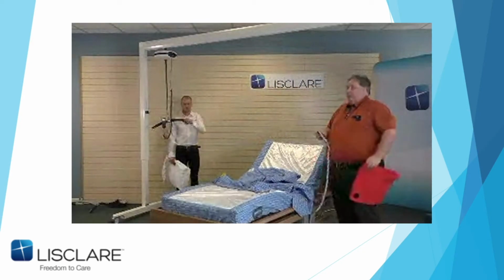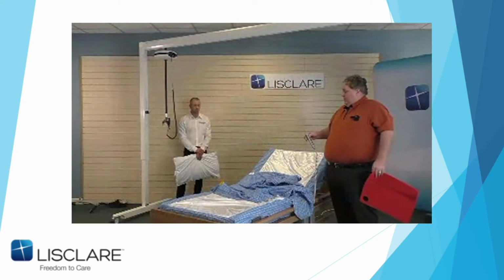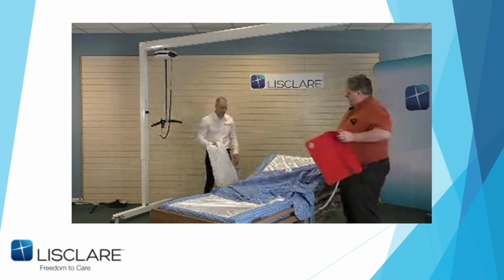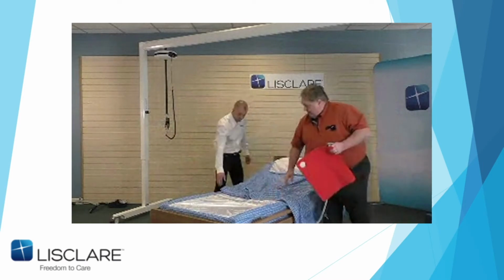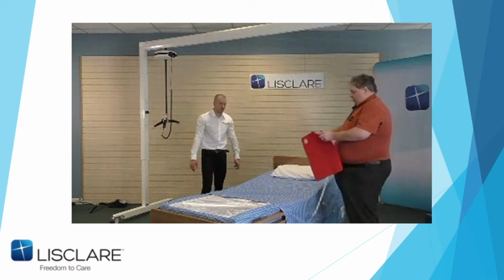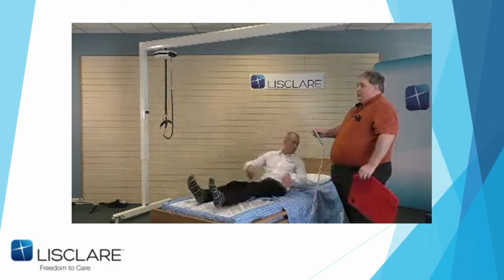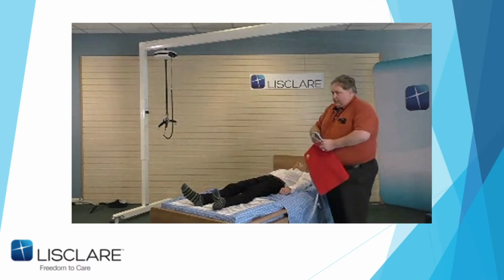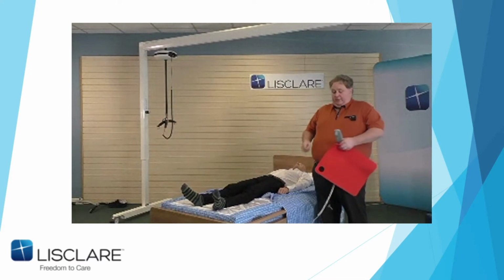There's different parts that we've missed out today. One's getting in and out of the bed because we just don't have the time. But I'll discuss that in a minute or two. When the patients are lowered onto this, if John just tidies it up, they're usually set flat on the hoist. Just to show you this, John gets to have a lie down again. Obviously, they're not getting onto it and then swivelling. That's a different way of doing that, which I'll not show today. So if I've moved about, what you can't see is when I put my hand on there and start doing this, when I lift my hand, it's still flat underneath.